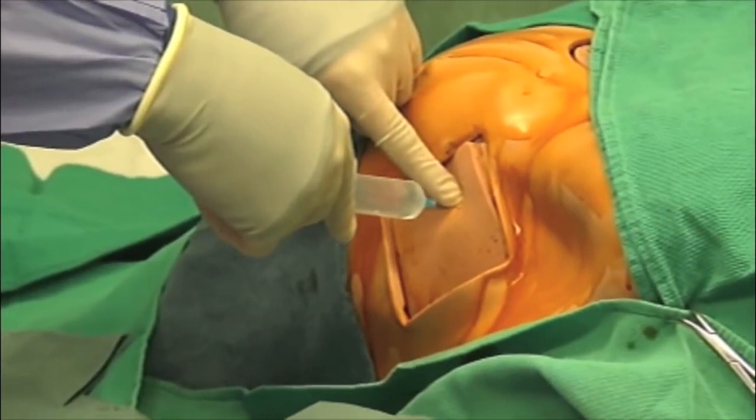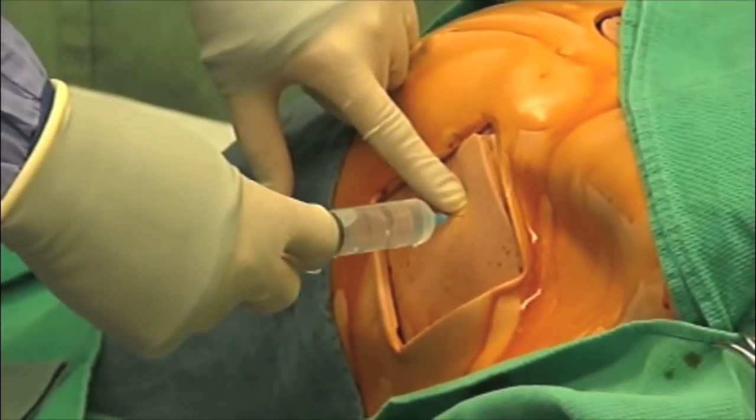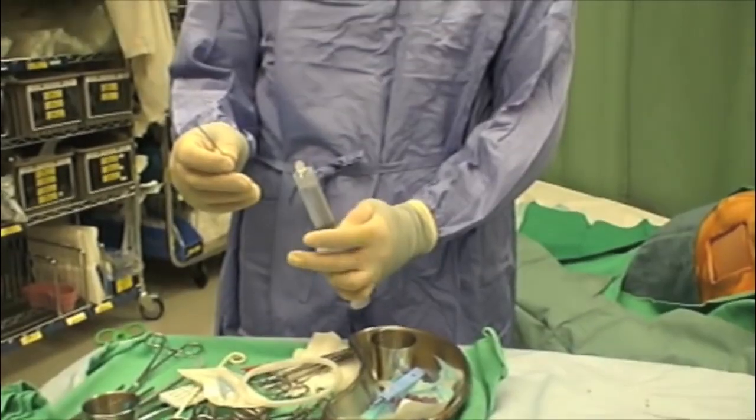Aspirate while advancing needle through subcutaneous tissue. Return of air indicates the parietal pleura has been reached. Note the depth reached by the seeker needle. Inject a bolus of local anesthetic to freeze the pleura.